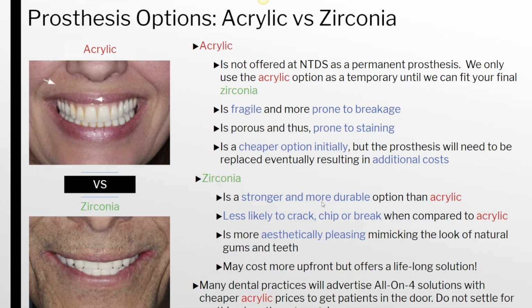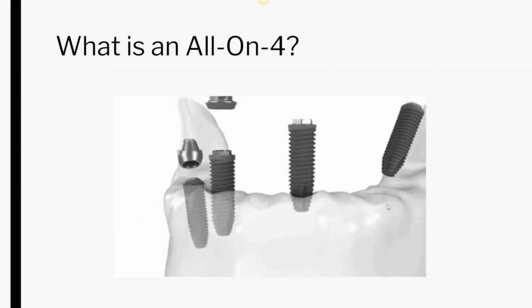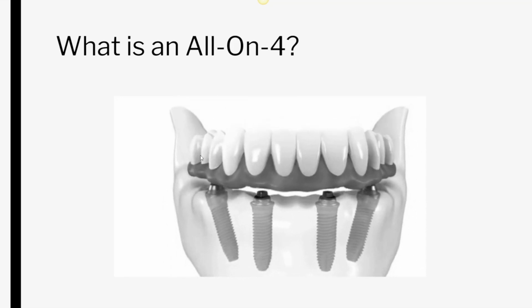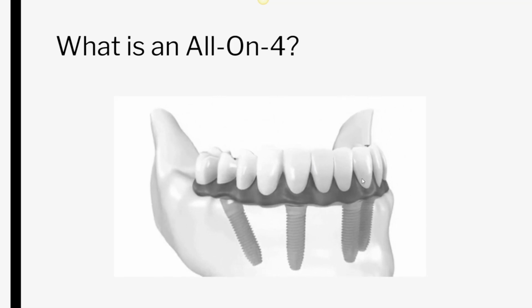So what are we talking about with the prosthesis? We're talking about what we see here, the visible gums and teeth. This is what gets screwed in on top of your dental implants. Of course, the dental implants are buried within your bone that we cannot see. This is what we call the actual prosthesis. Within that animation, this is the dental implants, these are the multi-angle unit abutments on top of it, and this is the prosthesis that we're going to be looking at, whether it's made in acrylic or zirconia. This is what we're interested in.